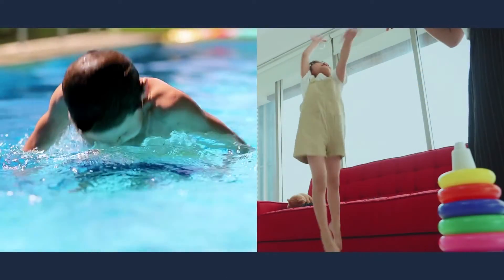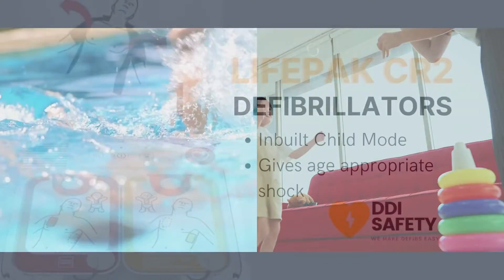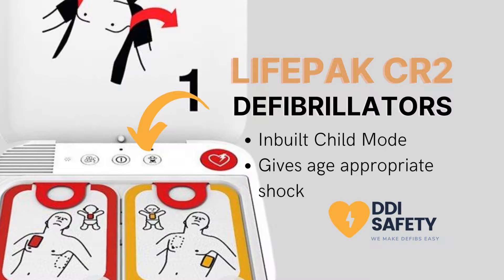In many situations, a child or infant could need resuscitation. The LifePack CR2 defibrillator has a built-in child mode. With the press of a button, this device can be put into a mode that delivers a suitable shock for kids under 8 or 25 kilos.